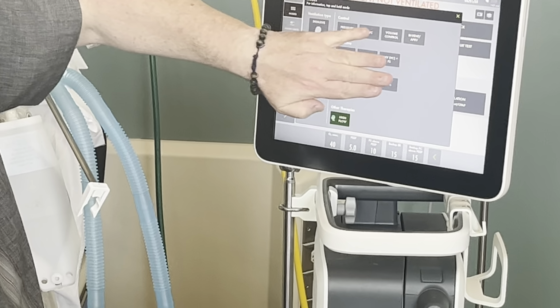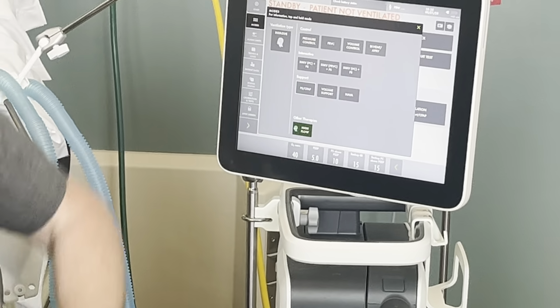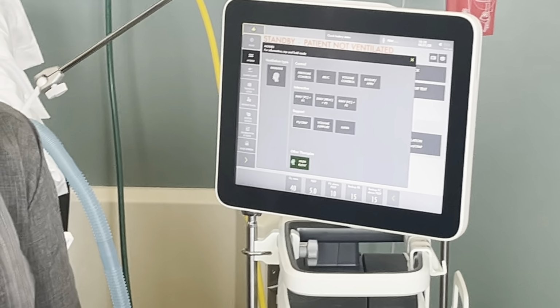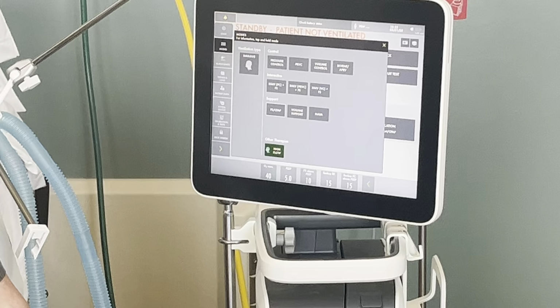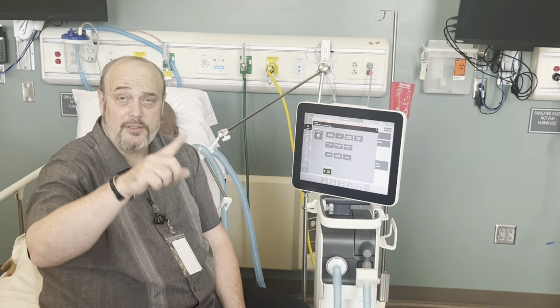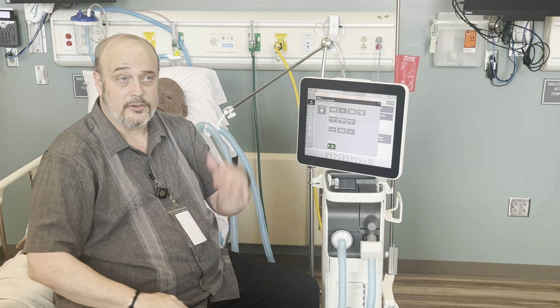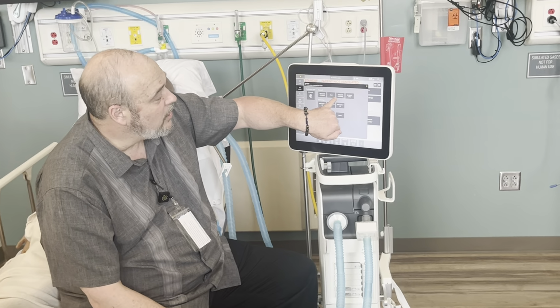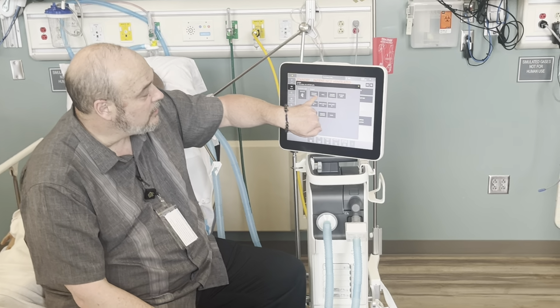But keep in mind, when you're using these up here, you don't, except for BiVent. There's always that one exception. BiVent, when you put the patient on there, there is a set rate that you give. Complicated, we'll worry about it another day, but they basically breathe on CPAP at the high level and the low level, where they breathe spontaneously. Don't worry about that today, that's way too much. These are the modes that Calvin's going to check you off on. Pressure control, PRVC, volume control.